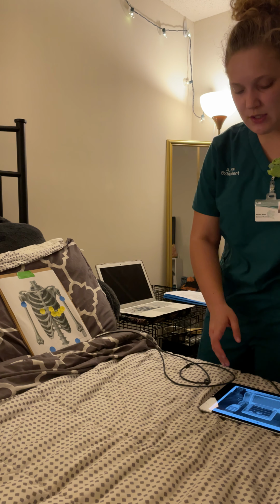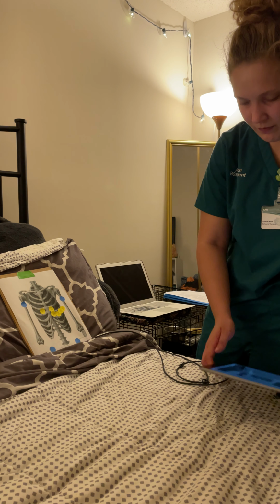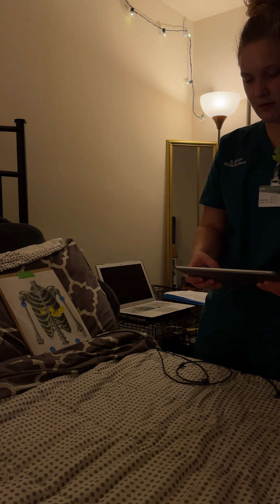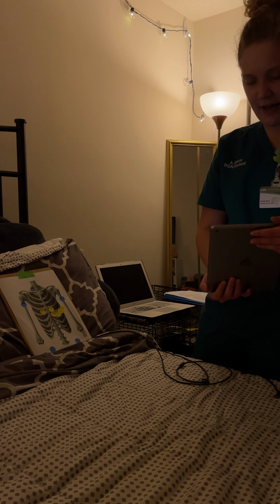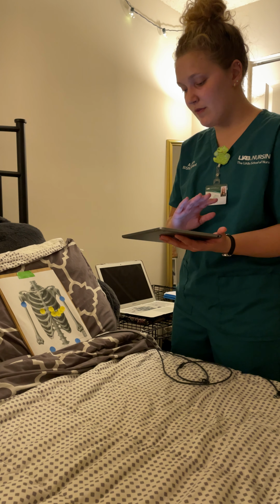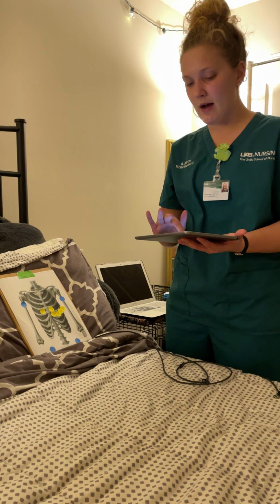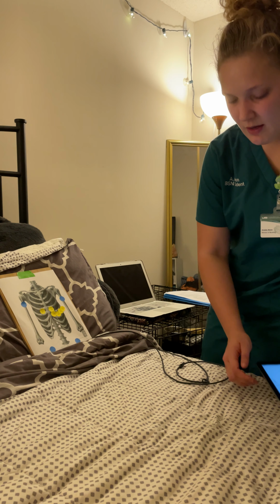Miss Gee, you can breathe normally, just stay very, very still, and I will start the EKG. Good. I'm going to head and start watching the rhythms. Okay, Miss Gee, you can relax. I have the rhythms in front of me, so I'm just going to check and see if there is any artifact, and everything looks great. So I'll be sure to give this to the provider so that they can go over and further assess what the further steps are.